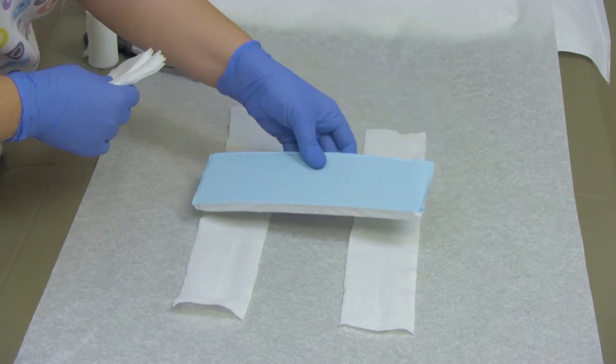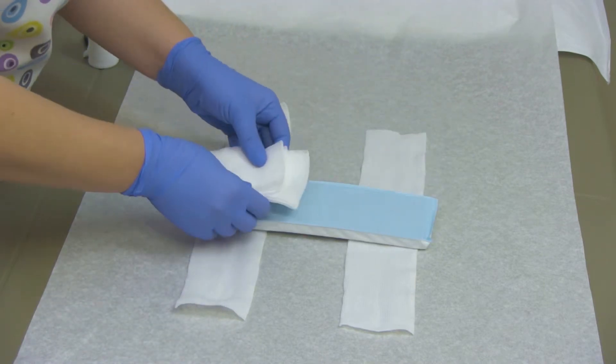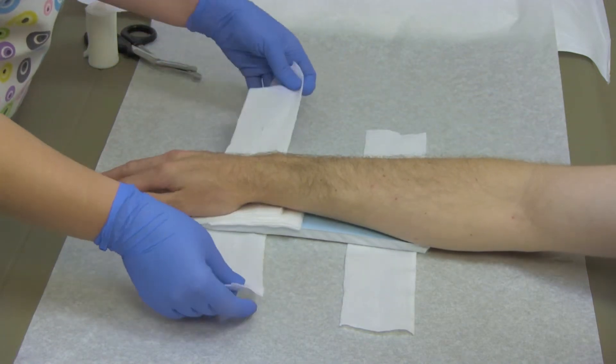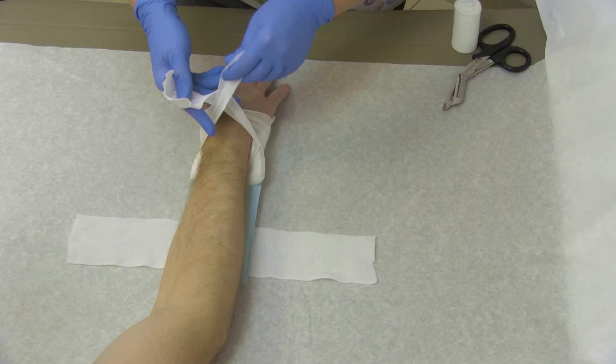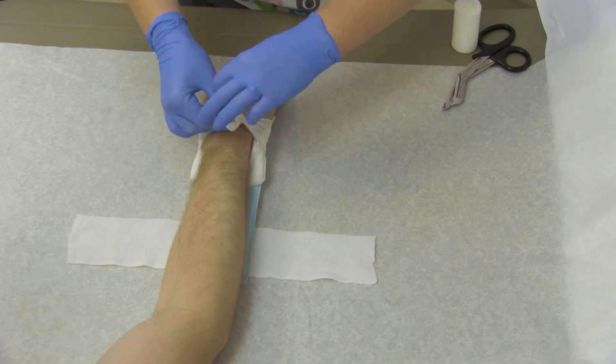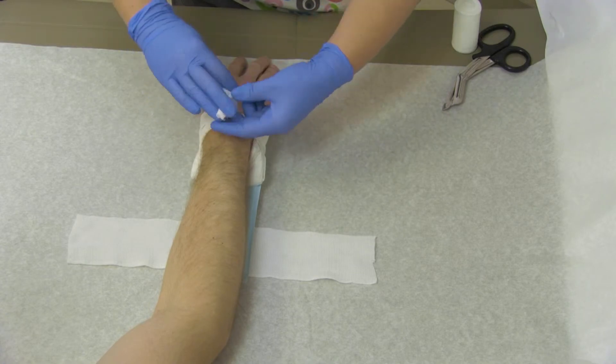Place the padded board under the injured area. Pad any gaps between the arm and the board with gauze or any other soft material. While keeping a calm and controlled manner, hold the splint in place with the gauze roller bandage.